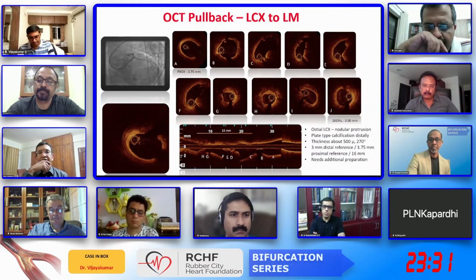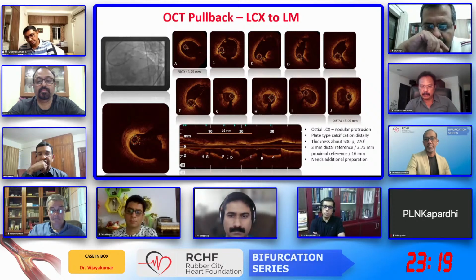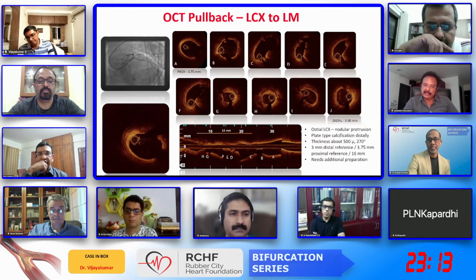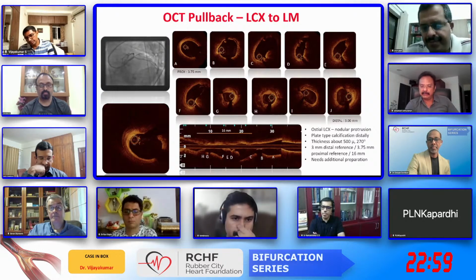Yeah. But my experience is that all nodules do not react in the same way. I have had cases similar to this, where with high pressure or cutting balloons, we have managed to get a stented area which is very decent or reasonably good. But similarly, I have had cases where we were unable to expand and we had under expansion in this area. That's again very important. Just based on this OCT, predicting the outcome of a calcific nodule is very, very difficult.